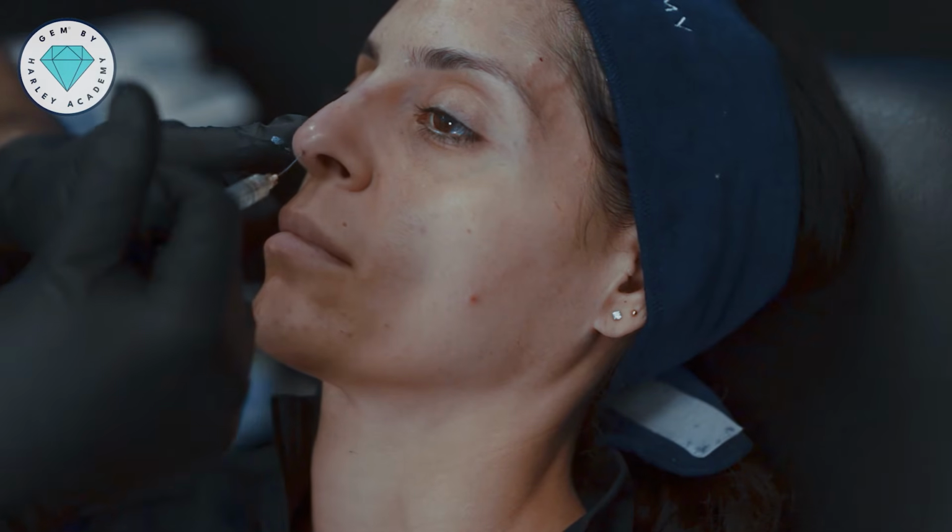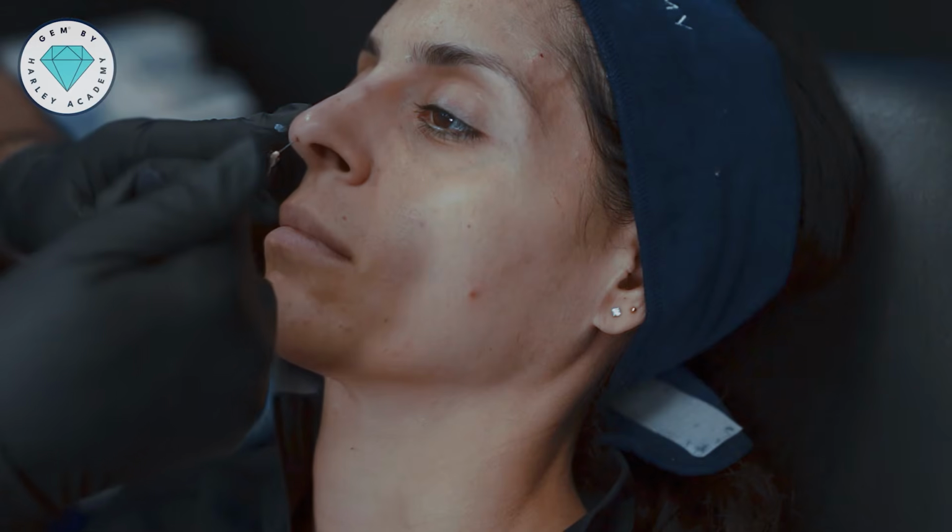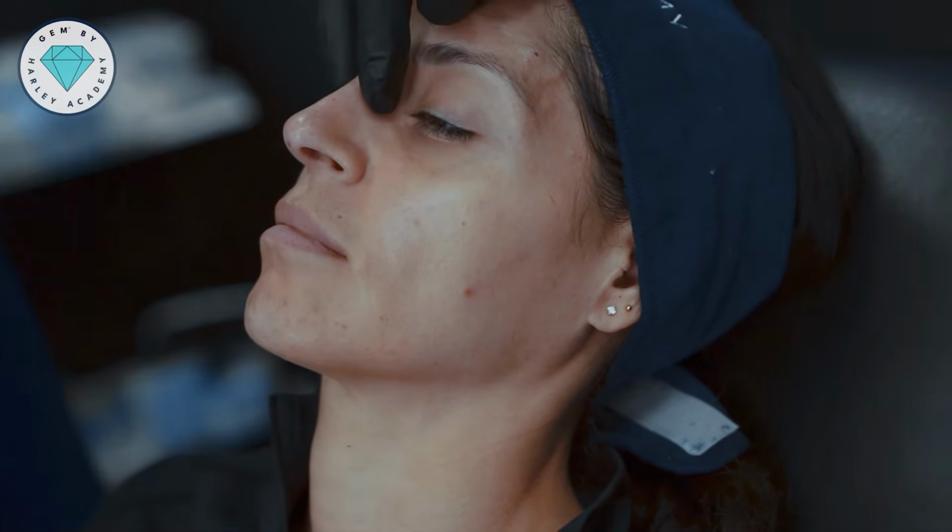What sort of volumes are you using here? So far I've almost used 0.5 ml. However, I think that is all we're going to need today.